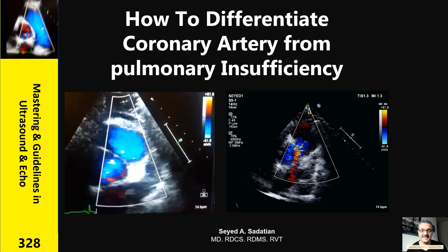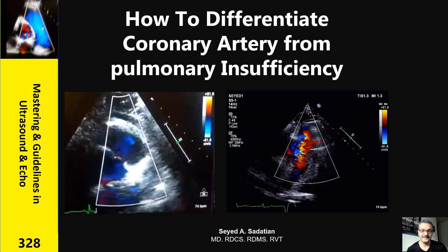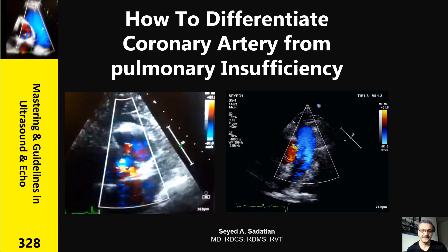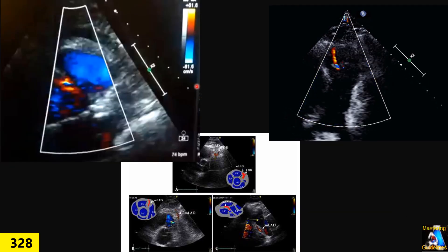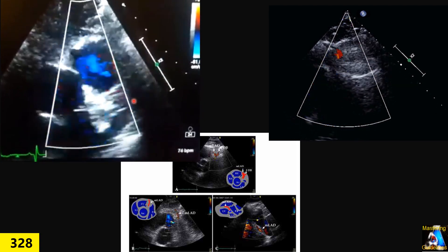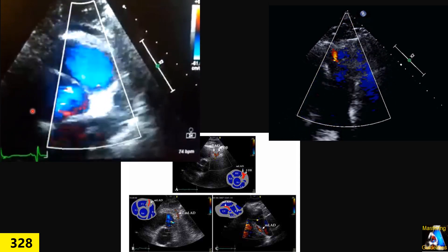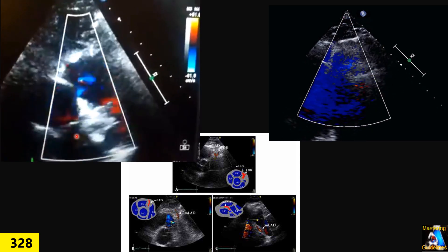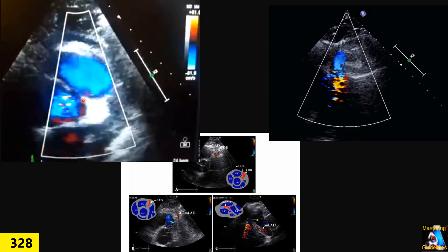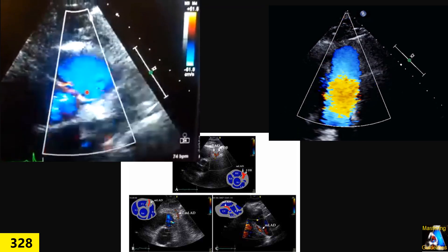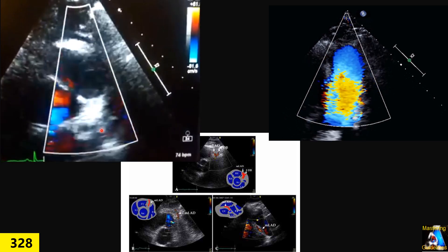Welcome to Mastering Guidelines in Ultrasound and ECHO. Hi everyone. Here we have a question that many members ask about: how we differentiate pulmonary regurgitation from coronary artery flow, because many times you will see blood flow at the level of the pulmonary valve. How can we differentiate?